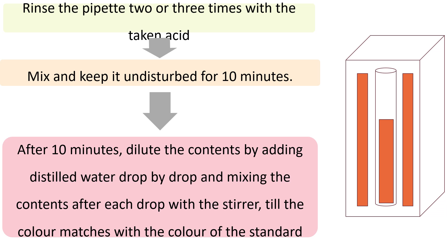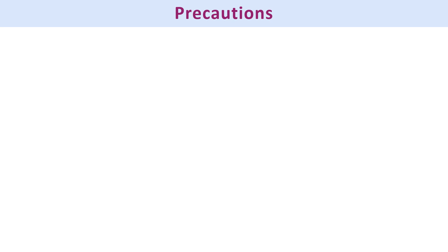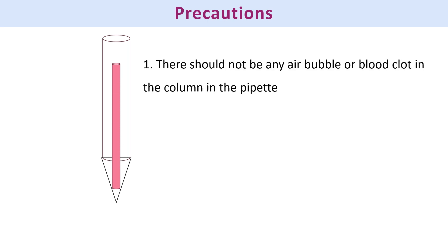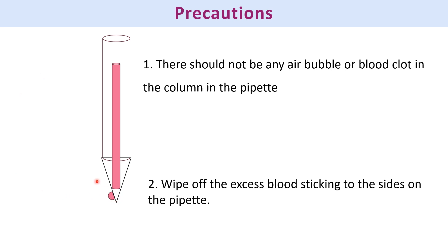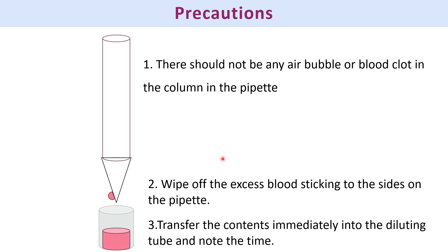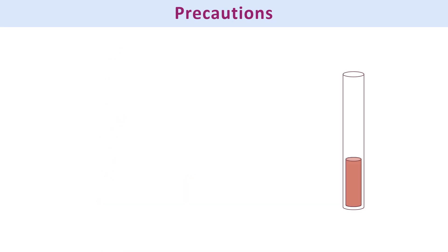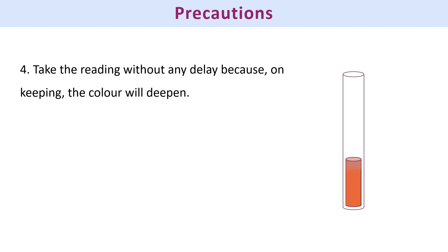Important precautions: when filling blood into the pipette, there should be no air bubble, as that interferes with the volume. Wipe off any blood drops sticking to the pipette. Transfer the contents immediately into the diluting tube and note the time — any delay causes the blood to clot inside the pipette. Take the reading without delay, because on keeping, the color tends to deepen.